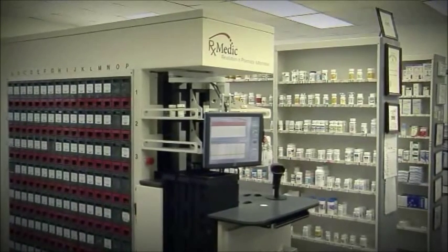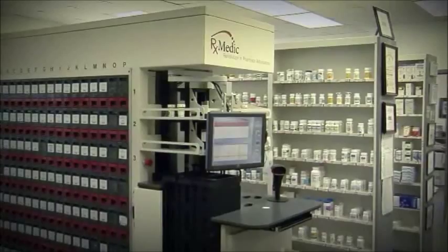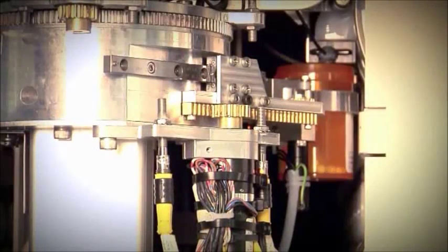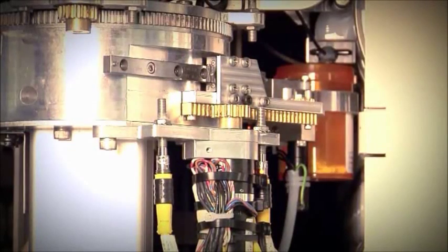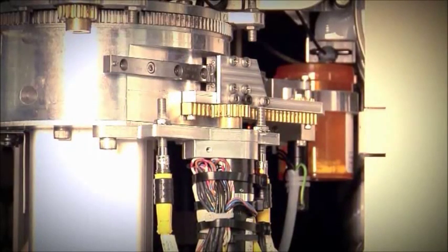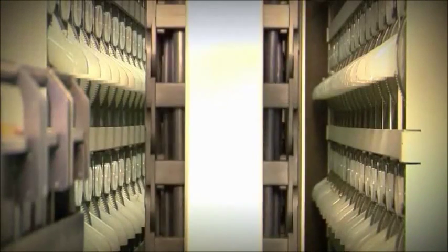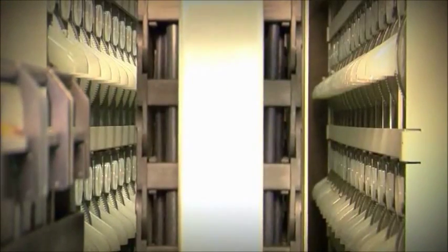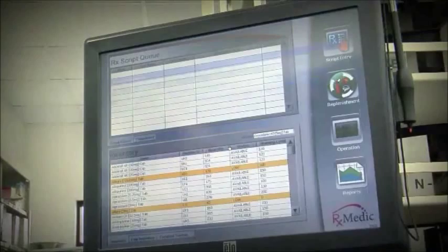The medication is rapidly and accurately counted and dispensed. This process guarantees that the correct medication is dispensed 100% of the time.